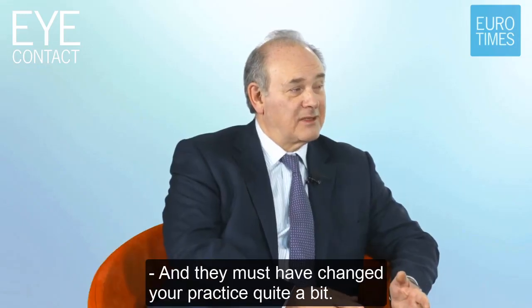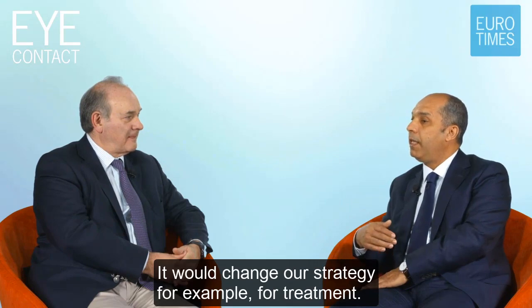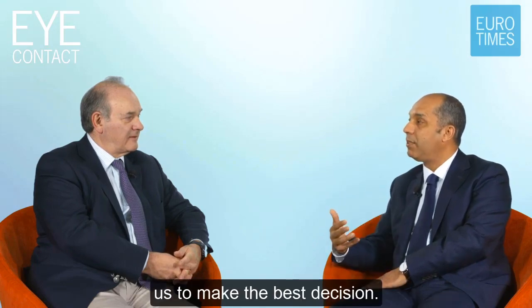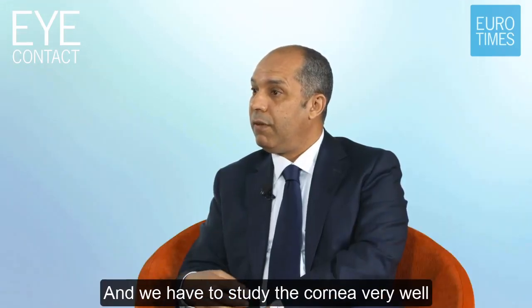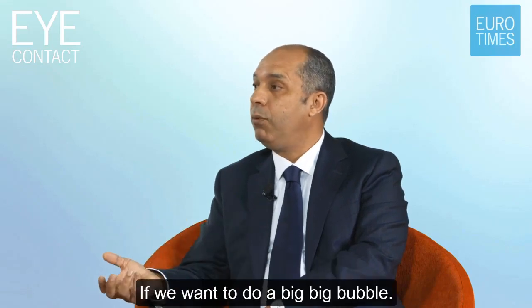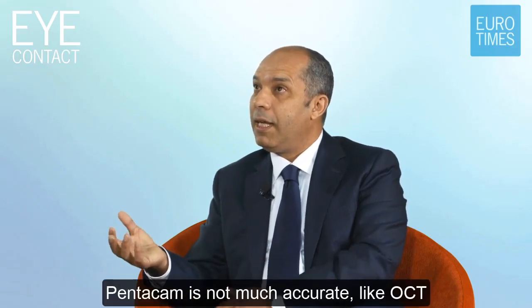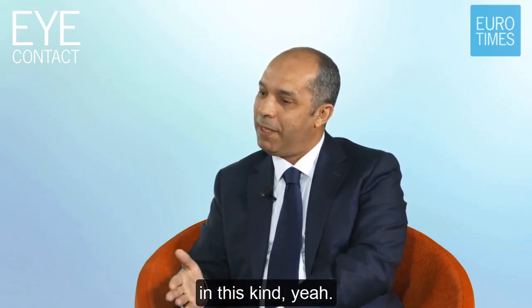Yeah. And it must have changed your practice quite a bit, I would have thought. In what way? Yes, it will change our practice. It will change our strategy, for example, for treatment. If we have more information about what is going on inside the cornea, it will help us make the best decision. So, for example, for lamellar surgery, OCT before surgery is very important, and we have to study the cornea very well to know where to put, for example, our needle if we want to do a big bubble. Okay. So we are not going to put it in the thinnest places. Pentacam is not as accurate as OCT in this kind of case, yeah. Okay.